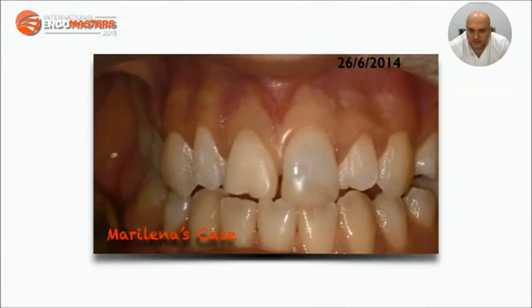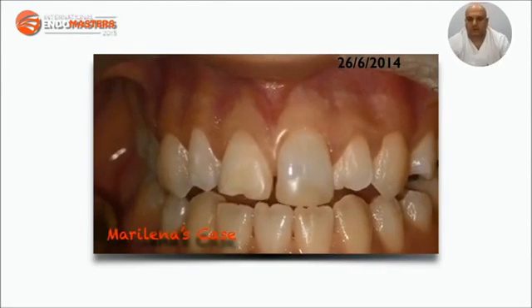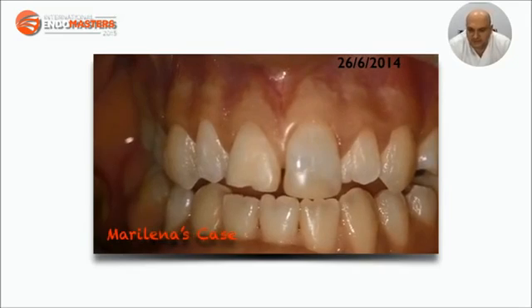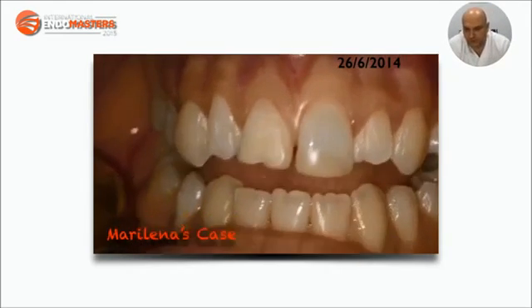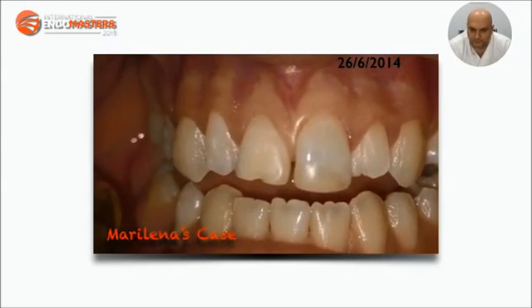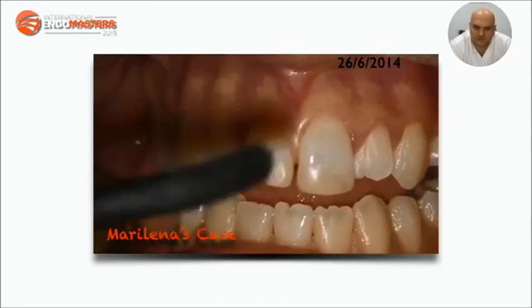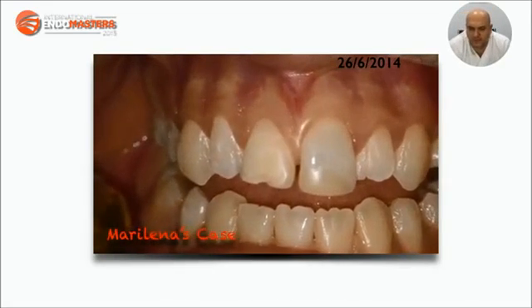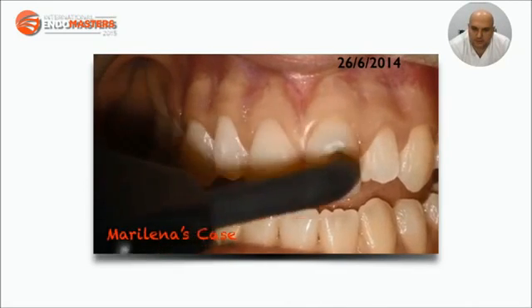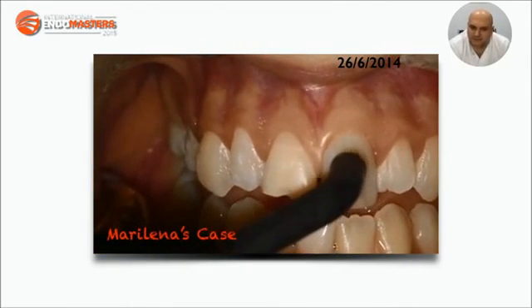And this is live, the clinical image of little Marlena's teeth 4.5 years later after the single-step revascularization procedure. No periodontal probing depth, no mobility, asymptomatic. And I placed this video here with the sound because it was the only way for me to describe the positive response of little Marlena to electric pulp testing.